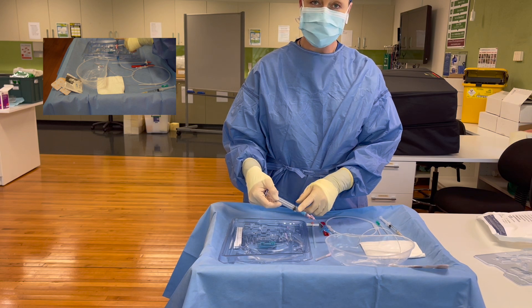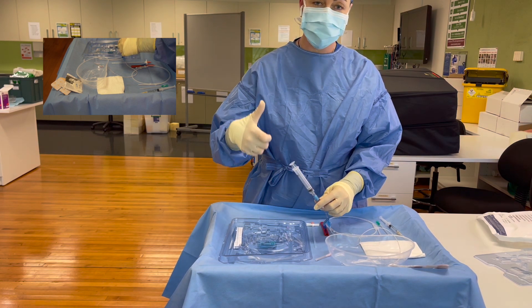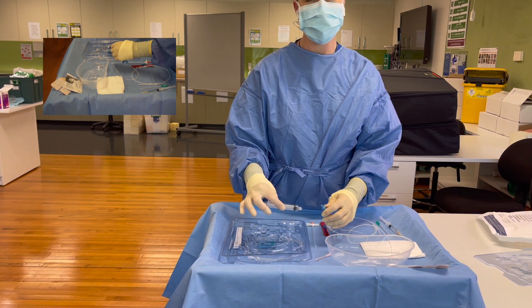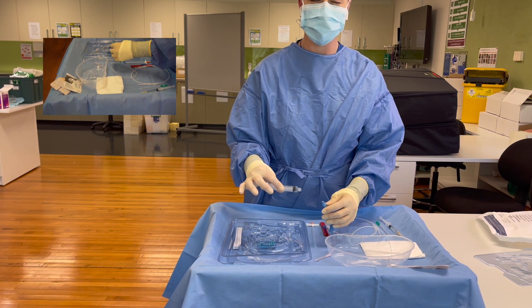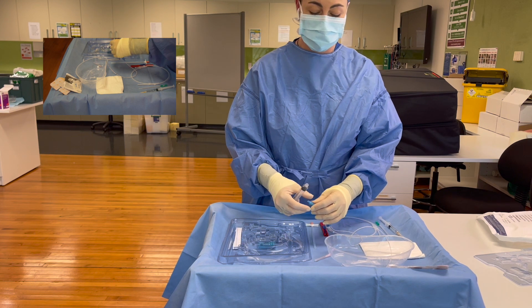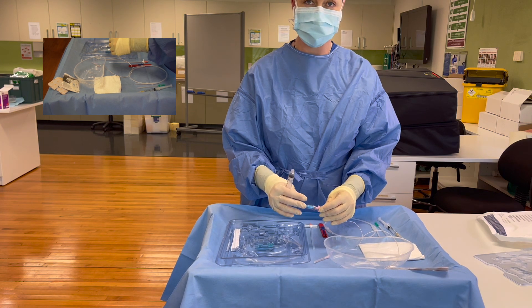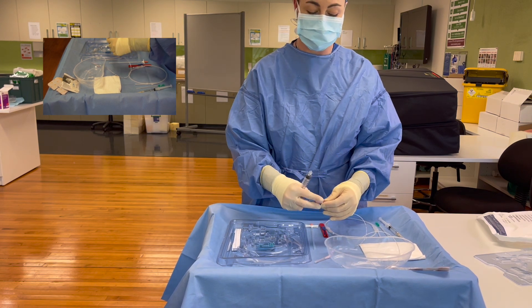You don't want to empty your syringe, so as you're pushing and pausing, make sure you don't empty it all the way down and disconnect it straight after a push. Let the bung — the positive pressure bung — exert its effect on the line.